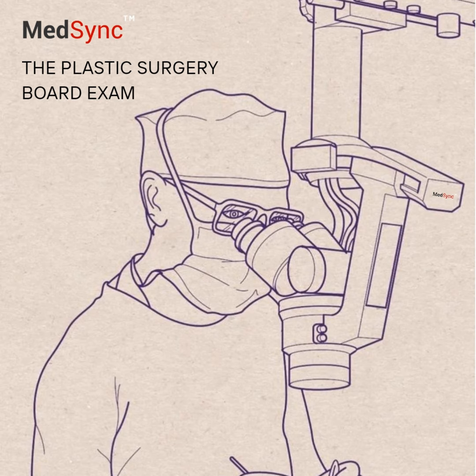IPL can also work, sometimes better for fairer hair. Best results usually on fair skin and dark hair. That combination gives the best differential absorption. And you need to target hair in the anagen or growing phase. Makes sense. Tattoo removal. Very common now.